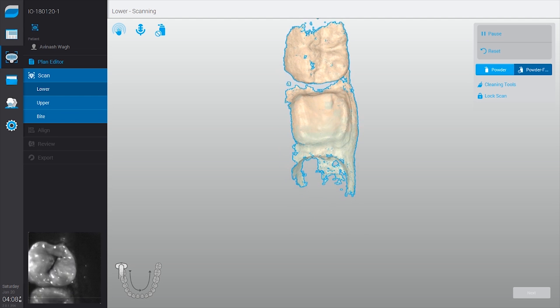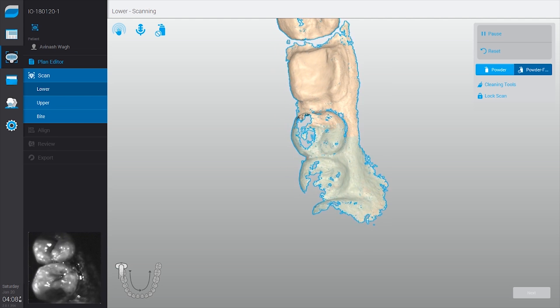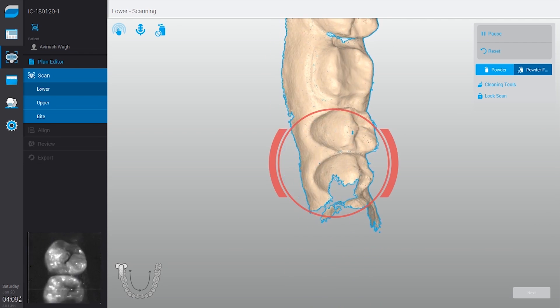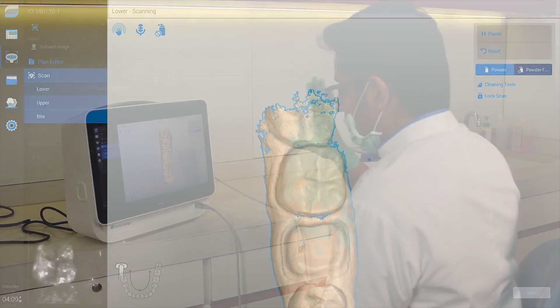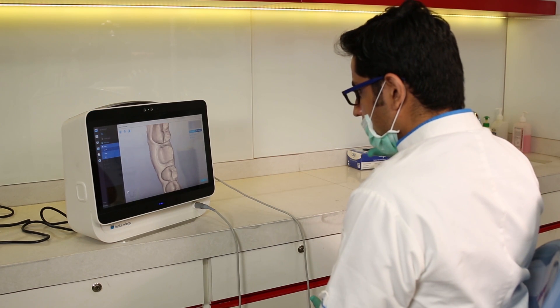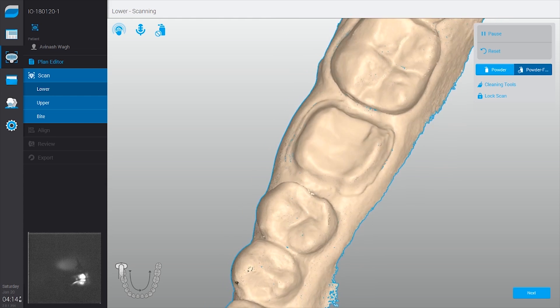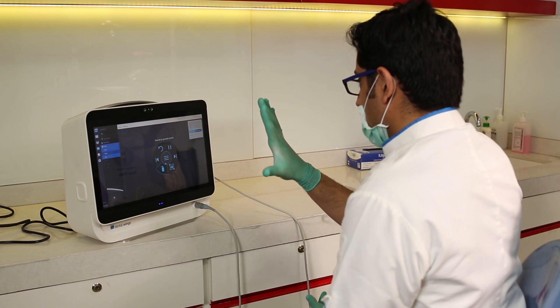You can see how I'm scanning with this handpiece, and because of the uniquely designed head it's very easy to capture the buccal and lingual aspects of the teeth. As I discussed in the last video, it's very important to maintain isolation and have a dry field while scanning. There are some very interesting features like gesture control, where I don't need to touch the screen at all — I can use a wide range of gestures to control the screen, which adds to the coolness of the system and also prevents cross contamination.